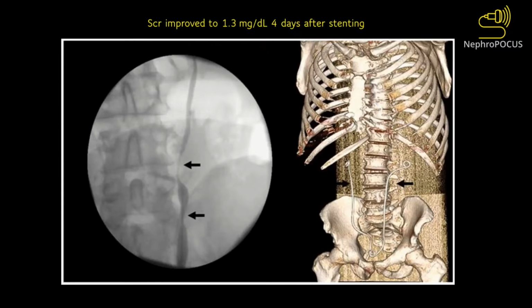And retroperitoneal fibrosis may do this. Also, you can see similar phenomena in patients who are severely volume depleted at presentation and who may develop hydronephrosis on repeat scans. I saw such a patient who had risk factors for obstruction, had some neurogenic bladder, and presented with AKI and hypercalcemia, probably hypercalcemia-induced diuresis, right? So the patient was severely volume depleted.